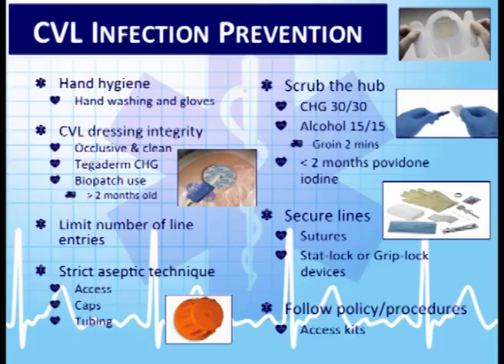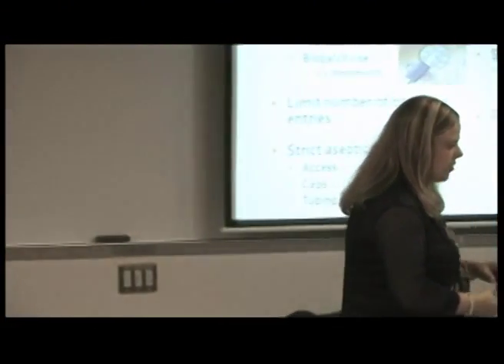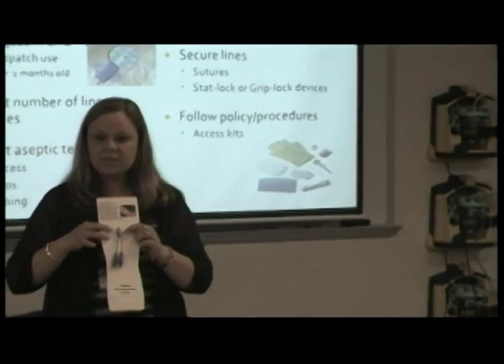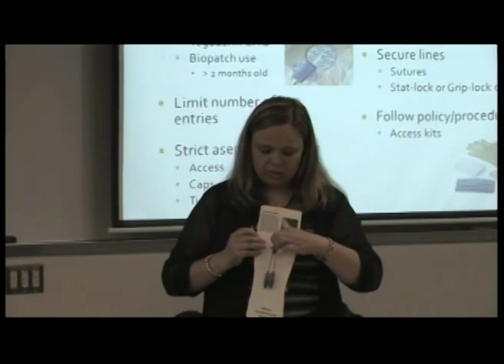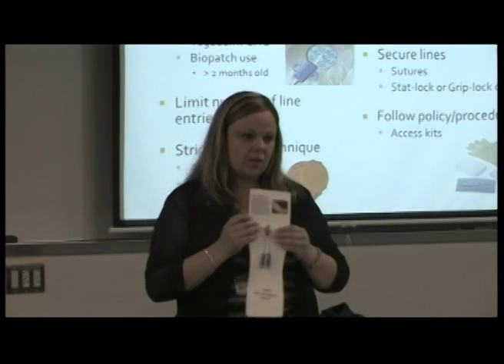Make sure our lines are secure. Facilities differ, and many of them may suture that central line in place. Others may use different devices. So some of the PICC lines have a securement device that hopefully will hold that nicely in place. Other ones will actually suture close to where this goes into the skin and hold in there.